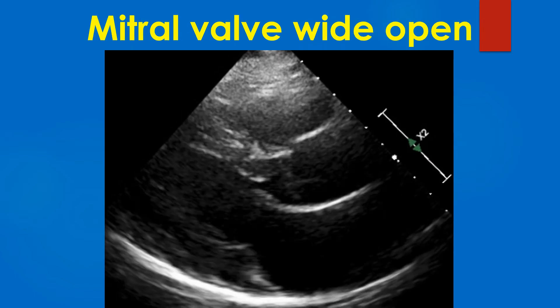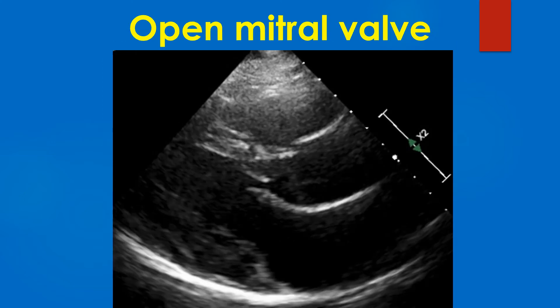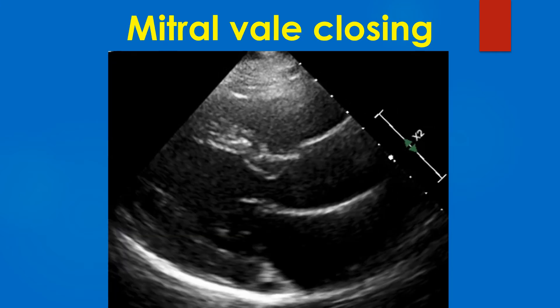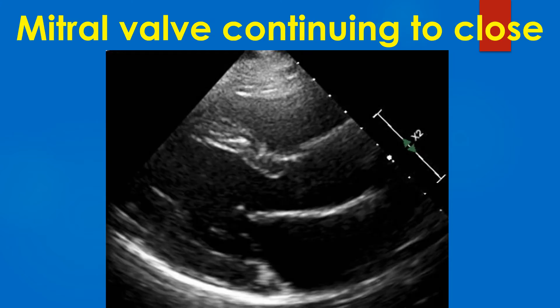The mitral valve is seen to be widely opened and the aortic valve closed. The anterior mitral leaflet almost reaches the interventricular septum, and the wide mitral orifice is visible. In one more frame with mitral valve opened and aortic valve closed, the mitral valve then starts closing and moves towards the posterior leaflet, moving further posteriorly.